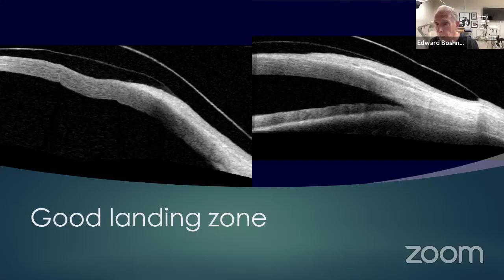But there's a very fine laboratory in the Netherlands that can work with a lot of the doctors on that. I think it's Visser Lens. Have you heard of that company, Visser? Yes. There are technologies out there that can help you out with that. Nothing is perfect. You just try to manage it as best you can.